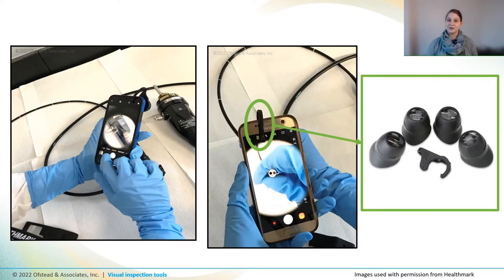Here's an example of an eye loop that can be attached to a phone or tablet to provide magnification and allow you to take photos of any defects that you find. The one downside is that you have to figure out how to clean and disinfect the eye loop and the tablet or phone. One of our biggest challenges when photographing defects is finding a way to stabilize the camera and hold it really still while taking a shot. It can help to brace your arm on a nearby surface or get help from a co-worker.